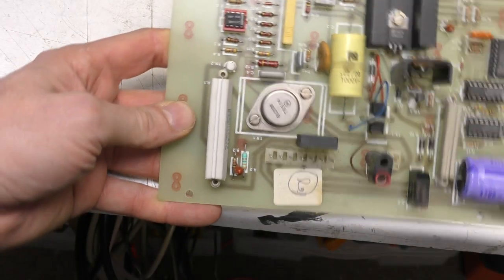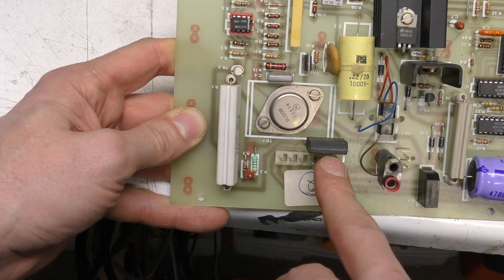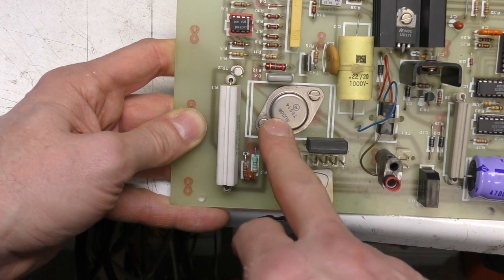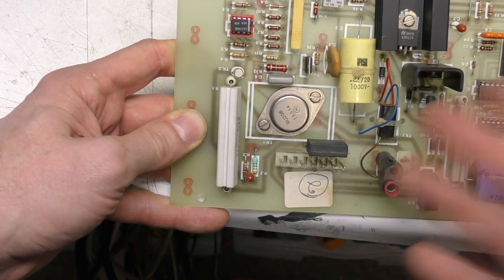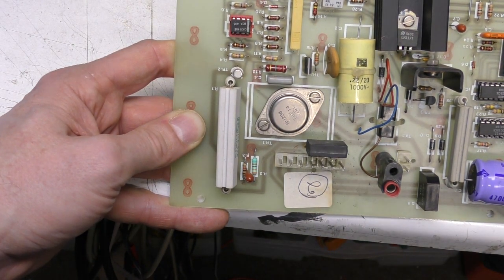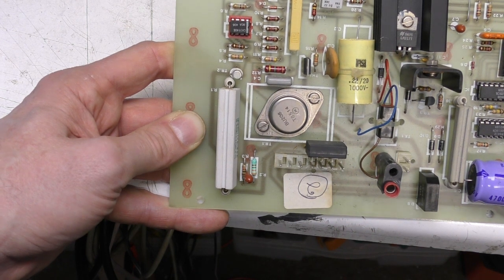So the high voltage comes off a transformer. There's a 320 volt AC winding on one of those two transformers. That gets rectified, goes through this resistor and this series pass transistor. So I think what they're doing is regulating the flash voltage, because obviously something like this needs to produce fairly consistent light output. So I suspect they're doing that by regulating the voltage that the flash capacitor is charged to, the capacitors on the actual chassis.